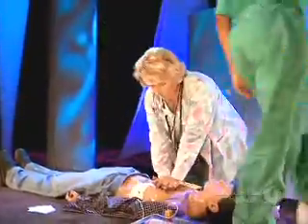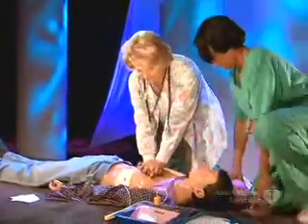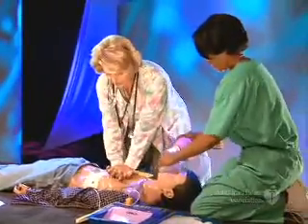Begin CPR. Repeat this sequence of CPR and AED use until advanced life support providers take over or the victim starts to move. So, now you know how to use an AED with 2 rescuer CPR.